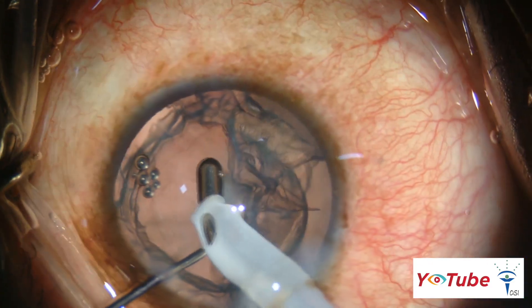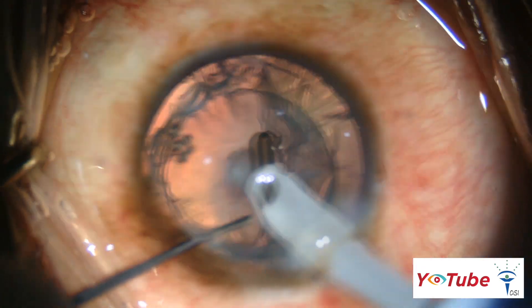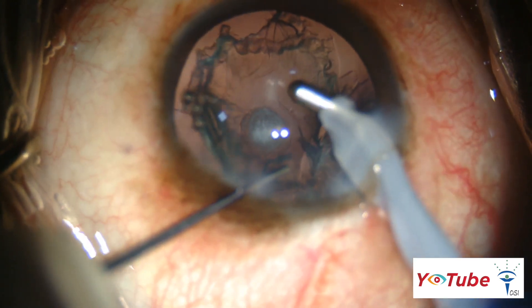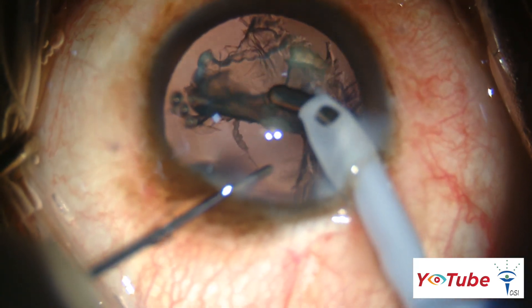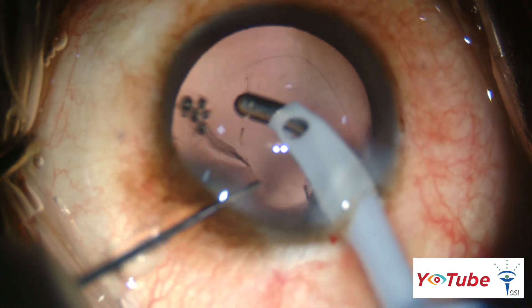The epinucleus is stripped 360 degrees from the capsular fornices before approaching the centrally attached plaque area, to avoid loss of epinuclear or cortical matter into the vitreous. The central plaque is left intact till the end, then slowly stripped and aspirated in a controlled manner. The cortical matter is removed in a similar fashion.